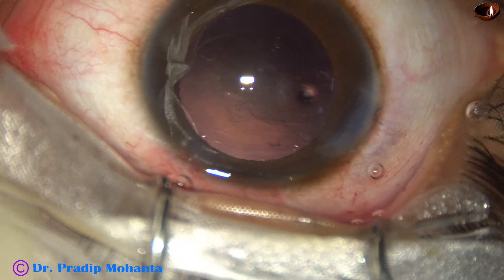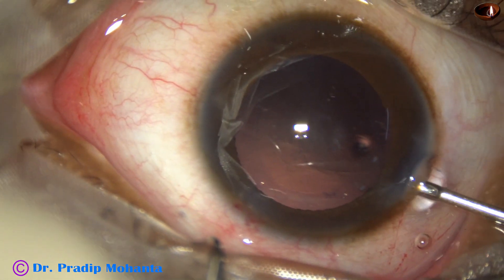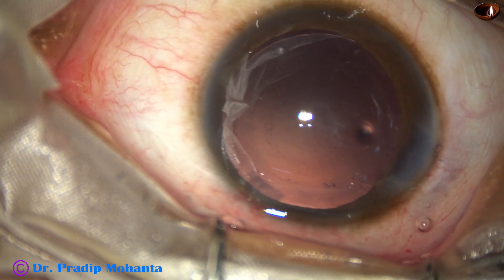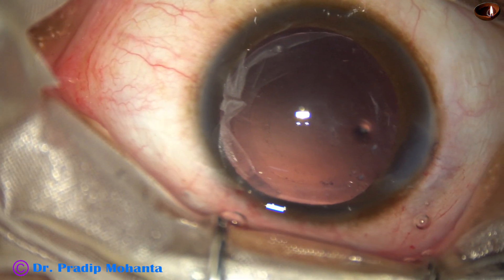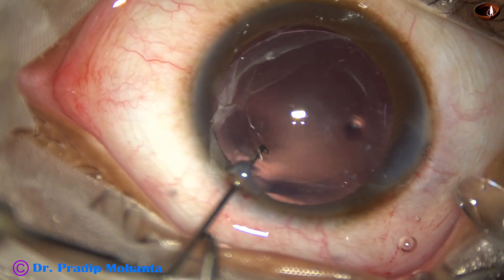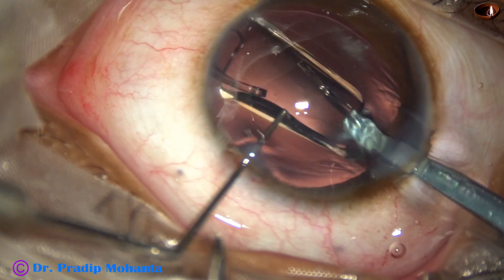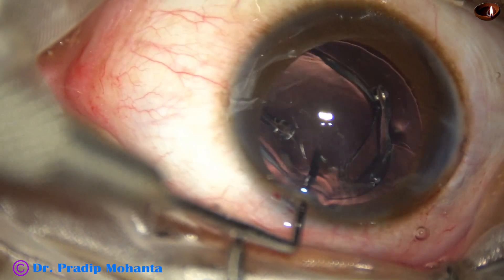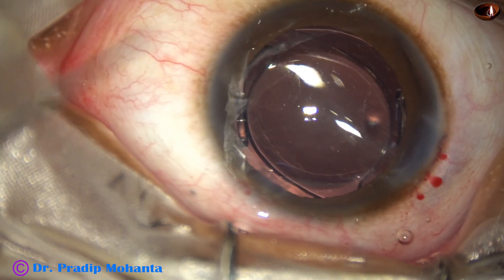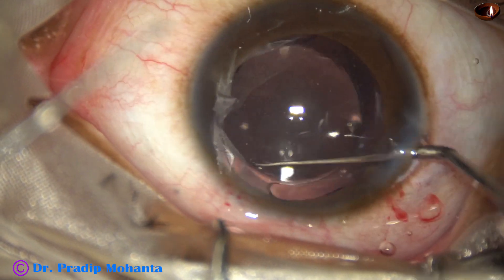Now inject viscoelastic, fill up the bag and anterior chamber, and implant a hydrophobic single-piece monofocal intraocular lens. This is a nice indigenous lens by Appasamy Associates — a hydrophobic lens known as Supraphope. No financial interest, but this is a good lens from Appasamy Associates — an Indian lens. The lens is nicely placed in the capsular bag.